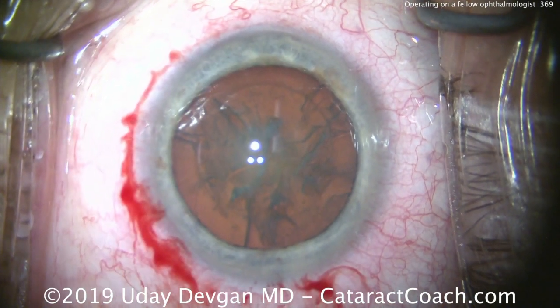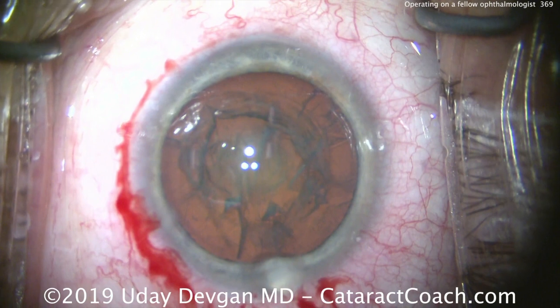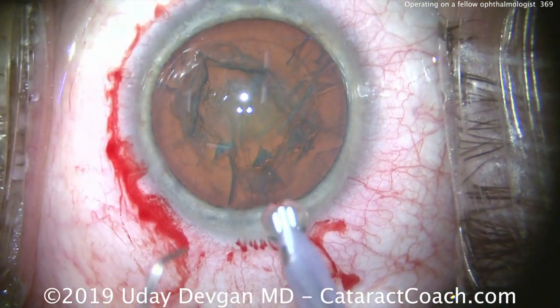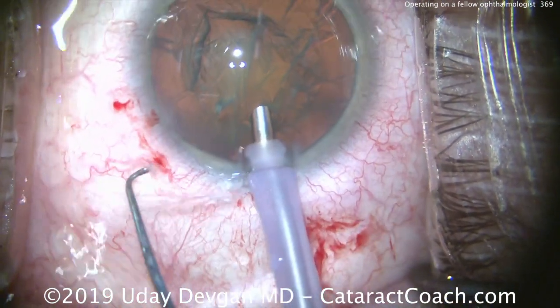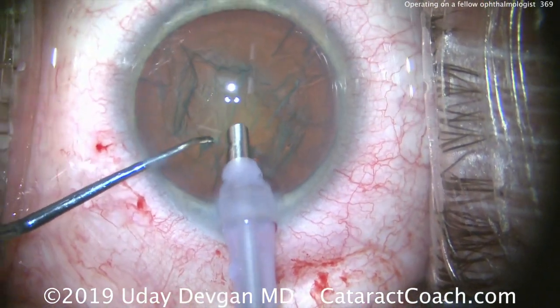I am going to try Dr. Rosatelli's spin technique as soon as we finish this virus stuff and I get back to the operating room. I would love to learn that technique. I'm going to try that. But here's just a little bit of hydrodissection, a little bit of rotation. And here's the phaco tip. And again, we're using the purple sleeve because it's a 2.8 incision.